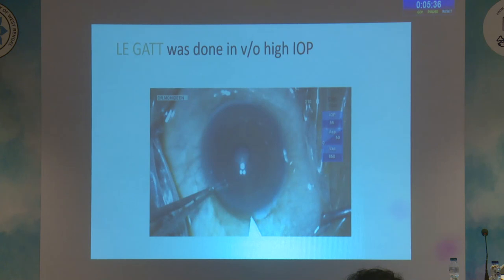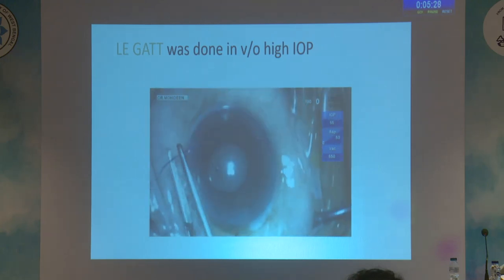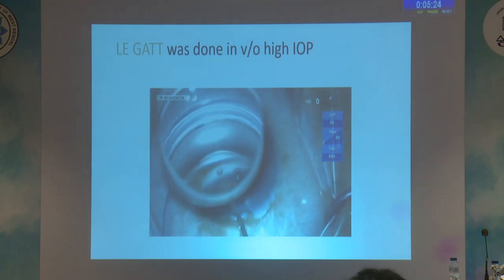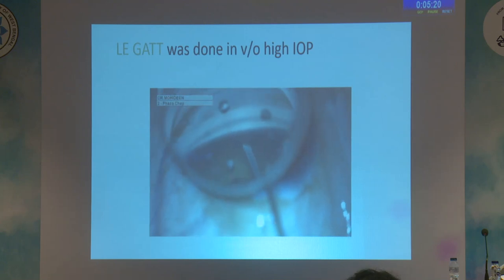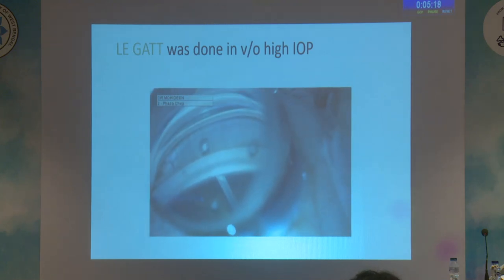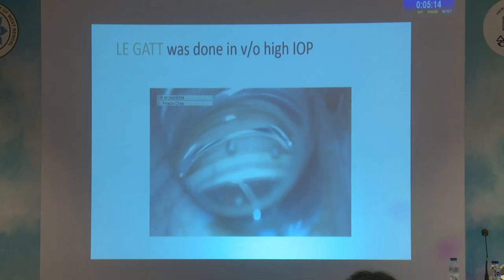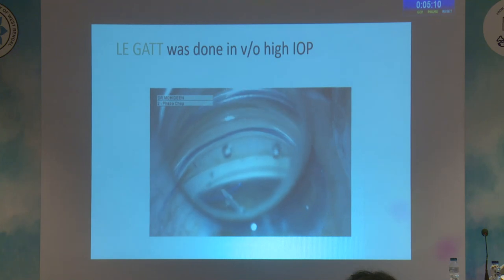So what to do next in the left eye? For the left eye, the patient was planned for gonioscopy assisted transluminal trabeculotomy, considering the high intraocular pressure and the complication in the right eye. After putting adequate viscoelastic and docking the gonio lens, a goniotomy was made and the Schlemm's canal was exposed.